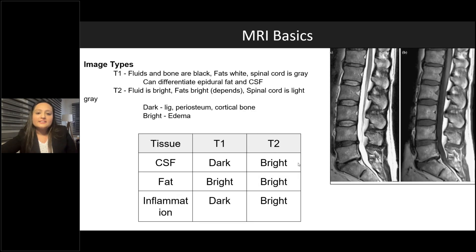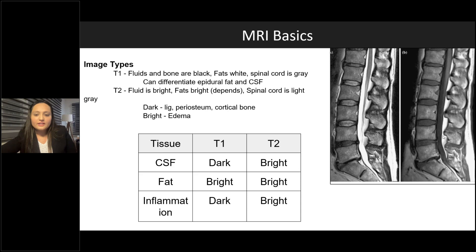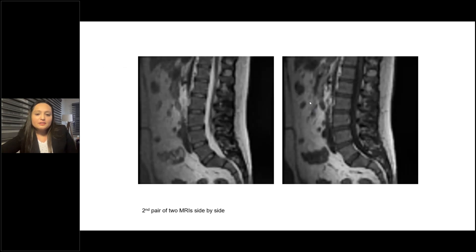There are two types of images pain physicians most commonly look at: T1 and T2-weighted. CSF is dark on T1 and white on T2. Epidural fat is bright (white) on both T1 and T2. Inflammation, swelling, or edema is dark on T1 and bright on T2. Looking at two spine images side by side, if the intervertebral discs show white content in the center — the nucleus pulposus — that's a T2-weighted image; if the discs are dark, that's T1.